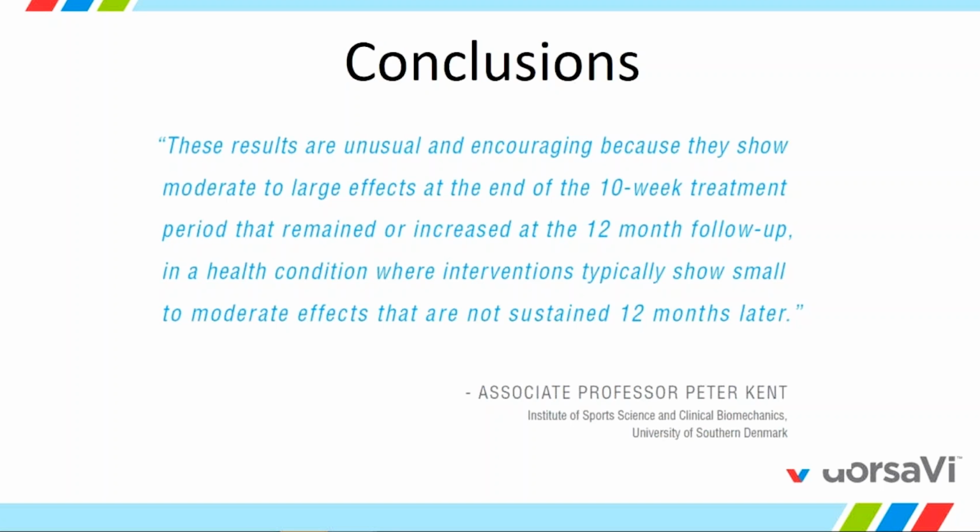We actually have a study, Wake Forest University is doing some research with us on adolescent idiopathic scoliosis. And one of the professors there, the reason he came to us is because he read this study. As soon as he read the study, he wrote to us and said, I think you guys just cured back pain. Now, that would be a lovely thing, of course, and an absolute miracle. But if you look at the way this study was done and what we can do, and even if you think about the way you can modify that into your practice by changing postural awareness and movement patterns, you're going to have amazing results.